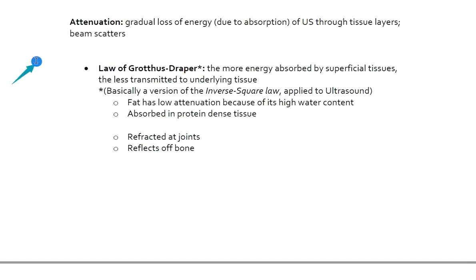So another thing that'll be important to be aware of is the concept of attenuation, and this certainly factors into laser, diathermy, and ultrasound. And attenuation is saying that absorption or that loss of energy with the sound waves, with the diathermy, with the laser, as different tissues receive that. You can imagine what will happen with sound. So if you've ever been in an auditorium with acoustic soundproofing, you'll notice that a lot of those things are meant to absorb the sound, so the sound doesn't travel as far.